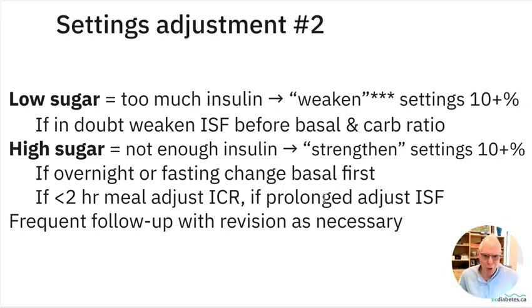Now, it's worth remembering, if the sugar's low, there's too much insulin around. And then we have to weaken our settings. Typically, we weaken them by 10% or more, often 20%, if the low was significant.